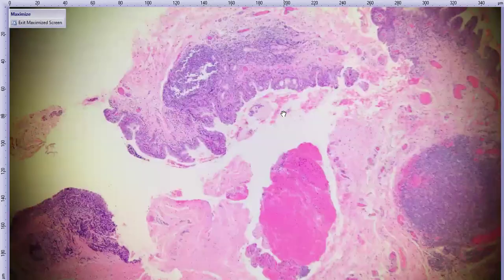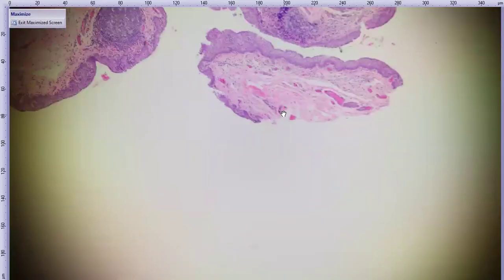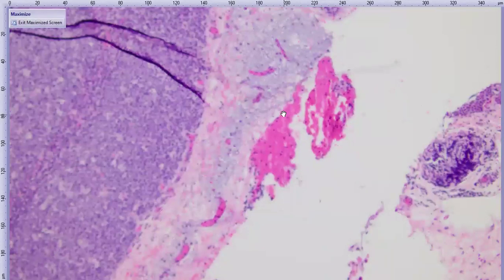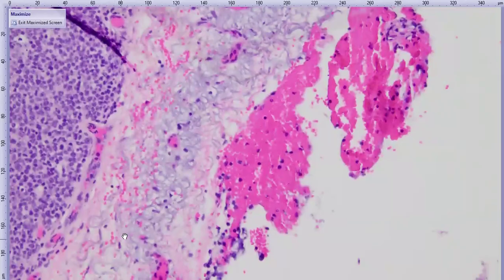And then to address, I'm looking for more of that blue stuff. There it is. So in the underlying stroma here, at least in the conjunctiva where we can see it a little bit better, this light blue stuff is light blue, undulant, prominent basophilic elastin fibers.